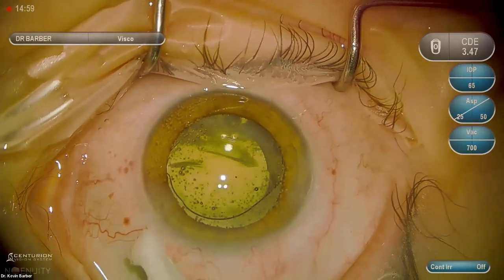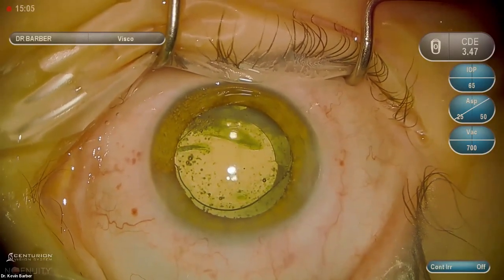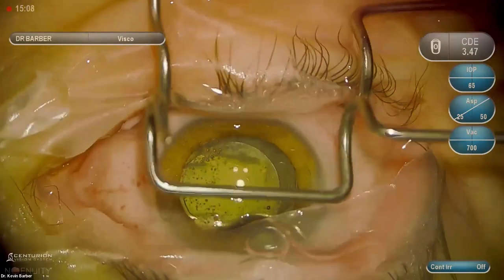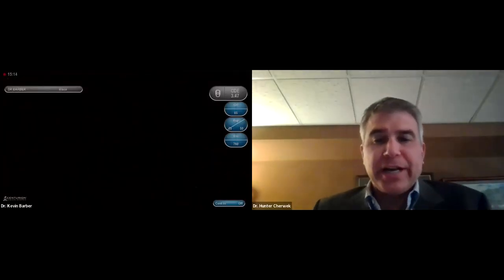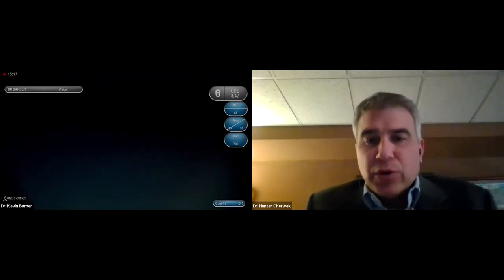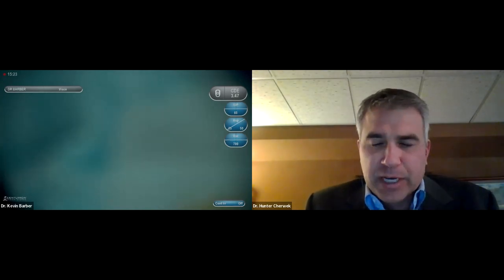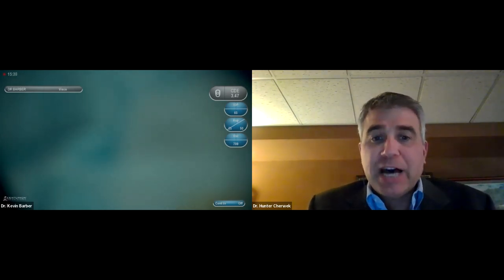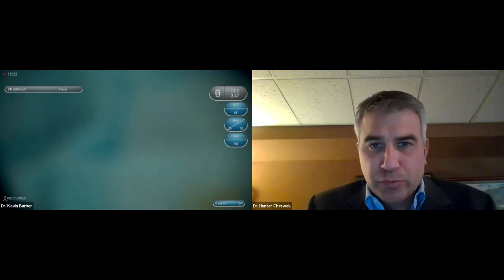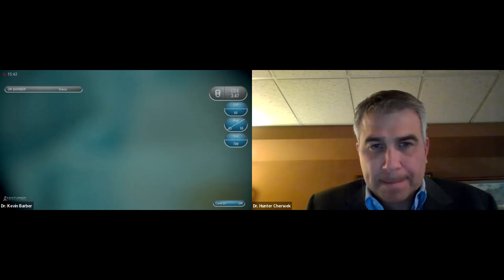I'll check my incisions — they are sealed and the eye is left with physiologic pressure. That concludes the first case. Kevin, do you prefer to make the main incision temporally or superiorly, and why do you prefer to make your incision manually rather than by femto?